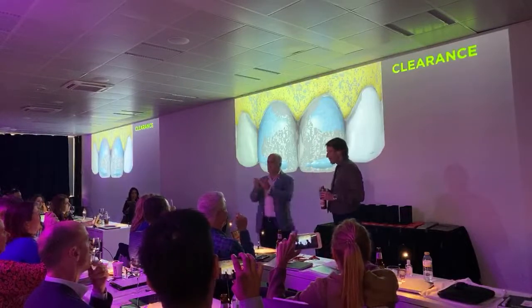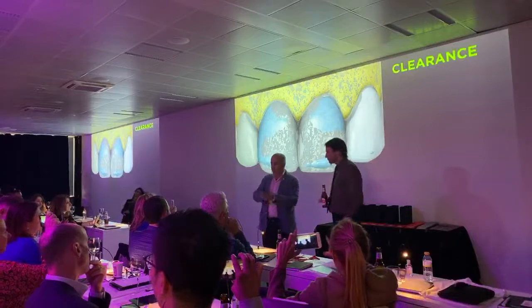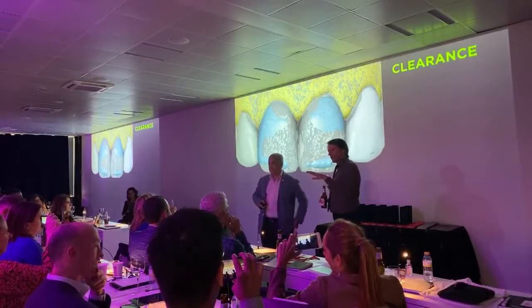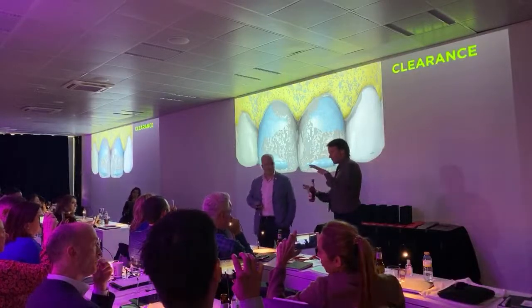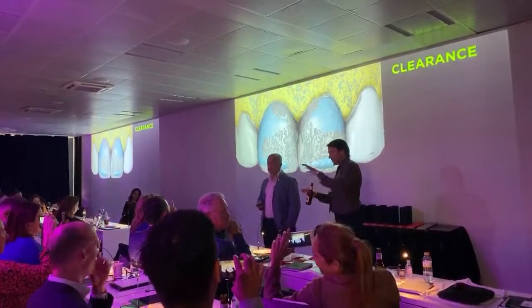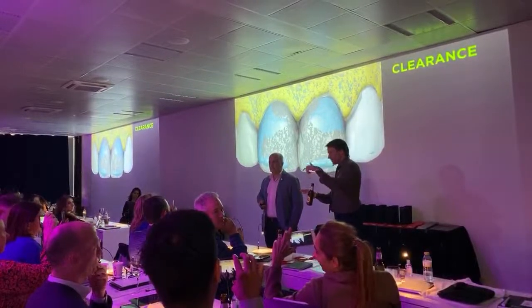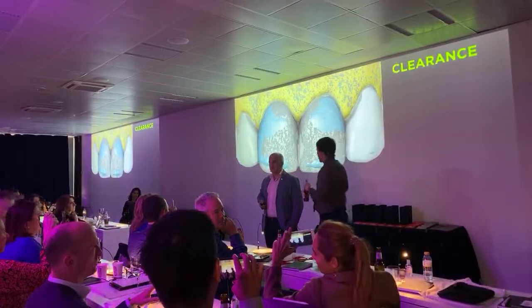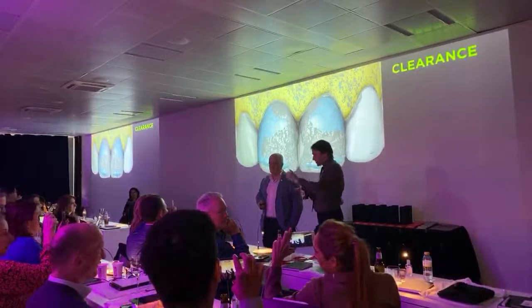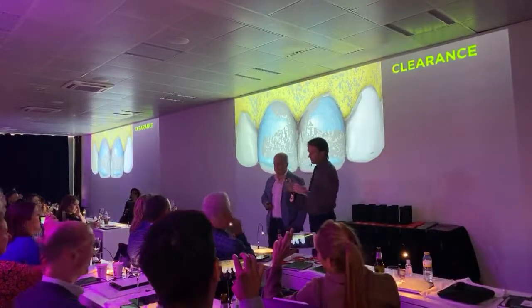It depends on the difference between what the patient wants and the stump shade. So we're going to have the final design. We overlap on the computer the final design to the existing situation. We know the stump shade and the final color, and we do the math and give it to you: for this case, to achieve the color that you want, you need 0.7, 0.5, 1.